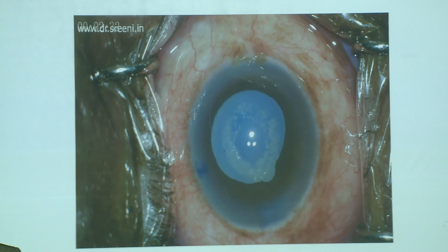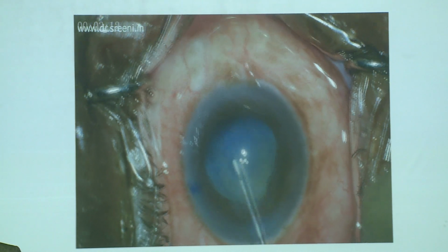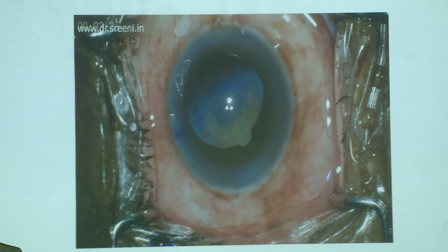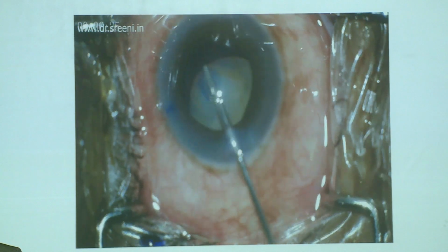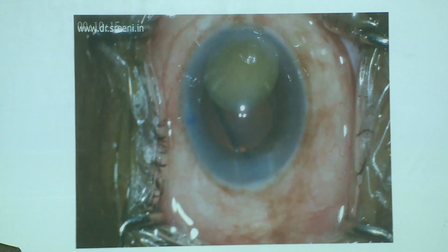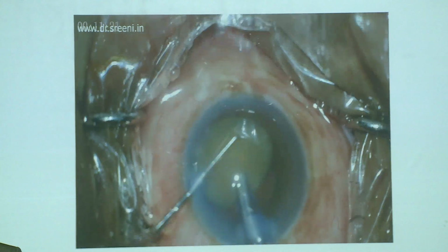So this is another problem that you can face. Phacolytic glaucoma case. You start the capsular rexis. The anterior capsule is very loose. You can see the whole bag is loose. So once you open the anterior capsule, the liquefied lens matter comes out, and what you see underneath is a small but dense nucleus. So you do phacoemulsification, try to keep it in the bag. The posterior capsule is very loose. It has a tendency to come to the phaco tip. So it is a bit dangerous.